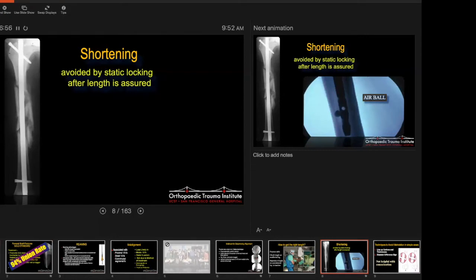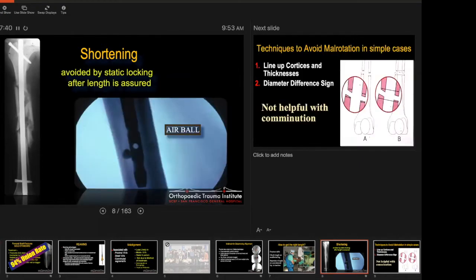How do we avoid shortening after we put the nail in? There have been cases at SFGH where the distal locking screw was missed or not placed and the patient had shortening. The way you avoid shortening is to nail and then lock every single nail. When you're out in practice and want to save that one step of not locking distally — don't save that step. It's worth the extra five minutes. Proximally you lock using the targeter; distally you lock with freehand technique. Get a good lateral view and make sure you completely black out the hole.